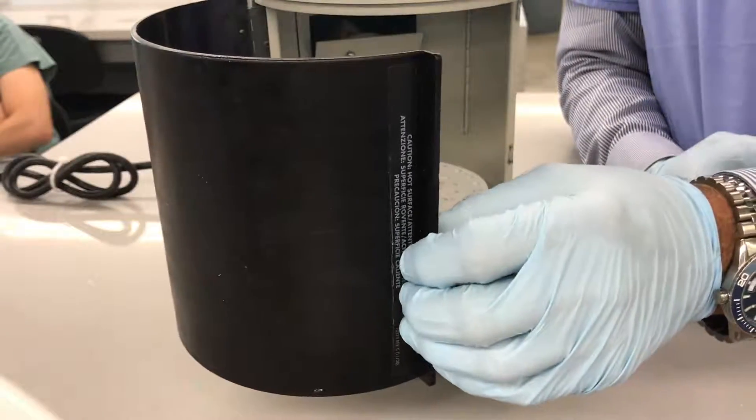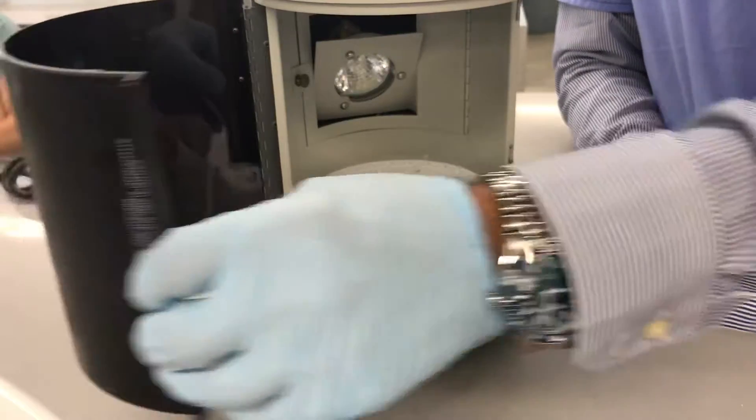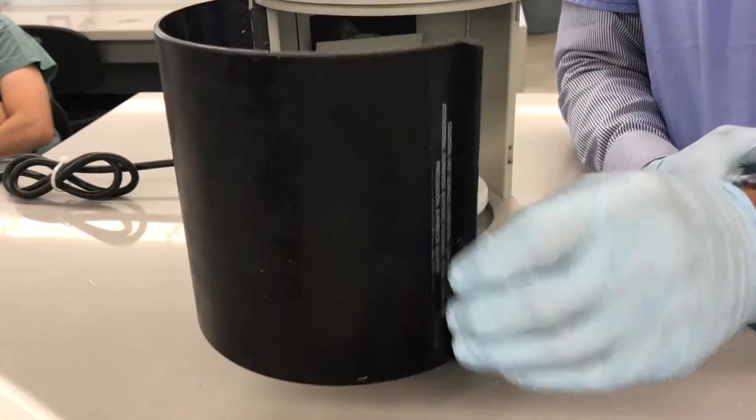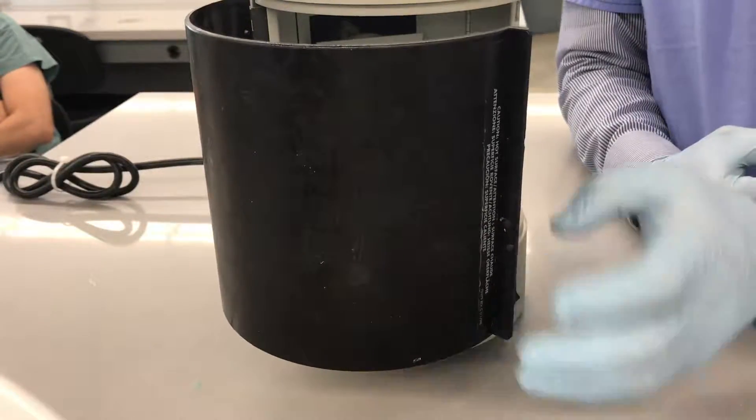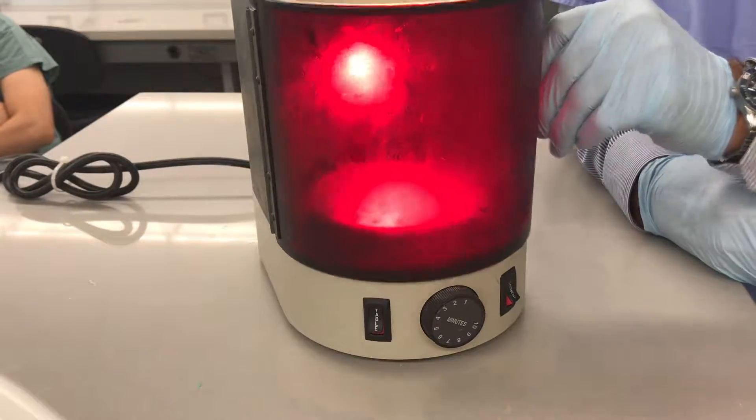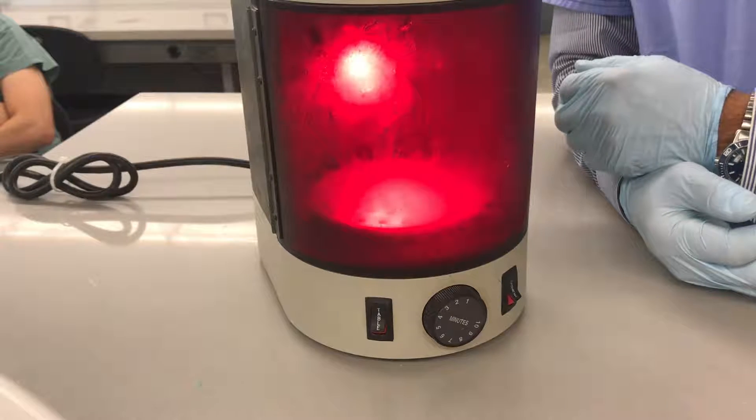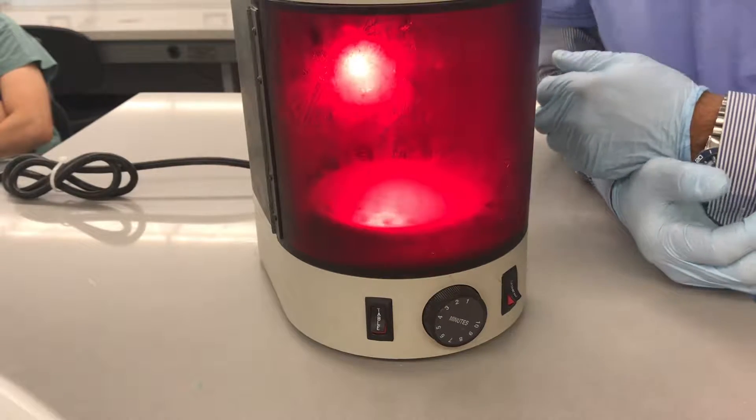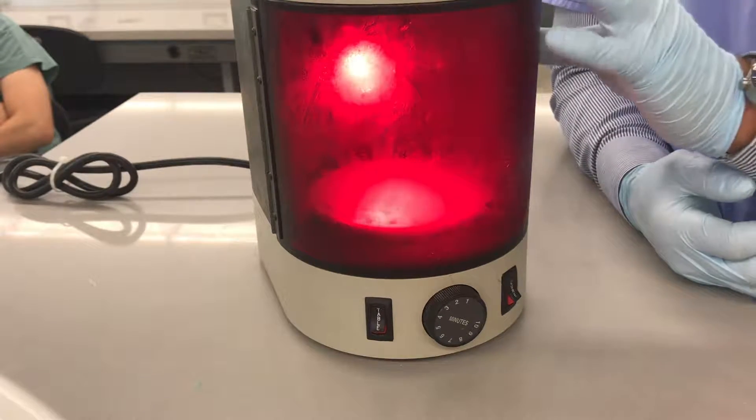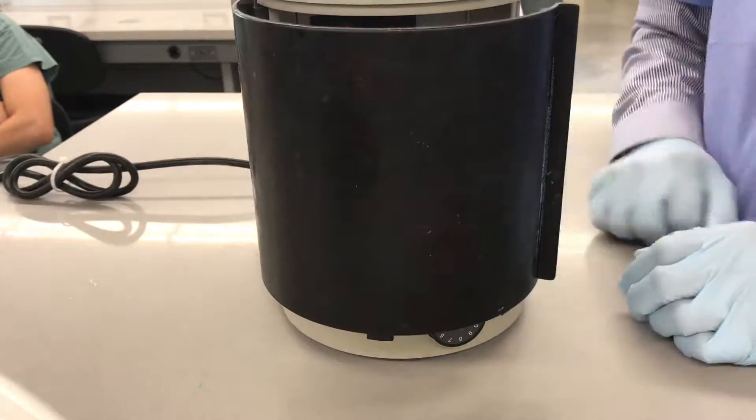To reset the timer, every time you open the door, the timer resets. So if you were at two minutes and you open the door after 30 seconds, you close the door, the timer will reset. As a good measure, just to make sure that it does, I turn it off.